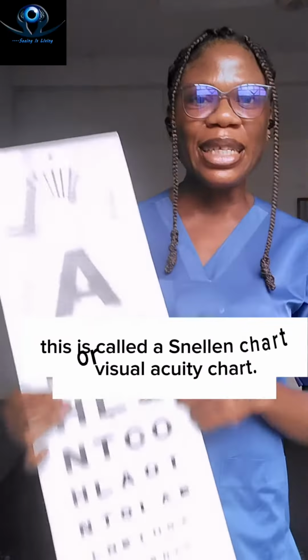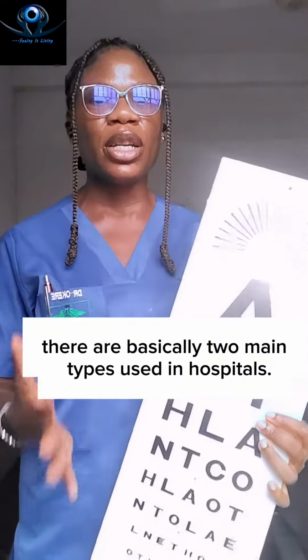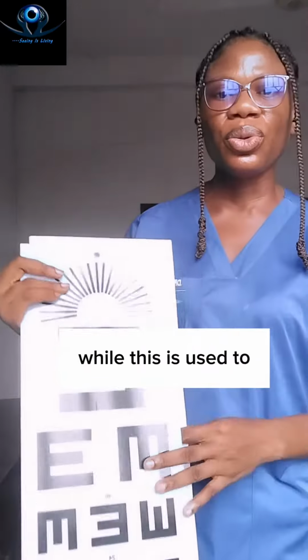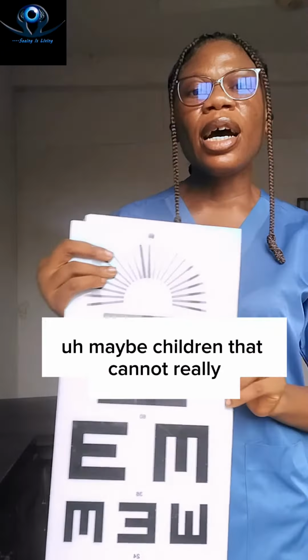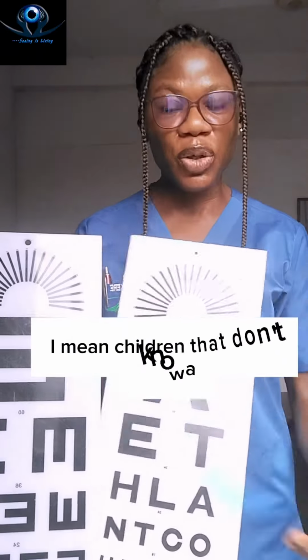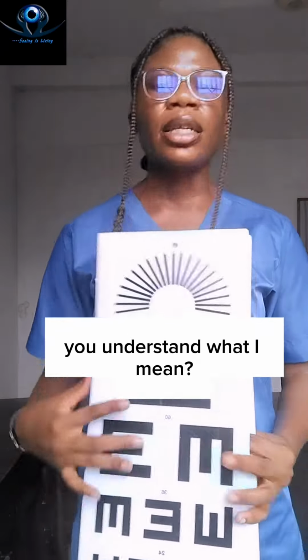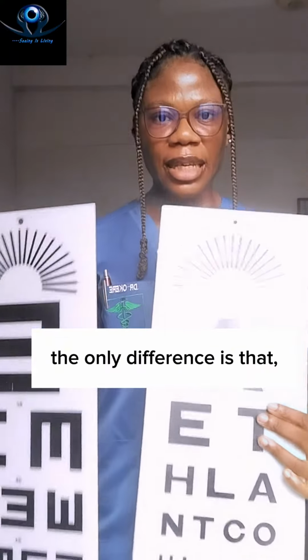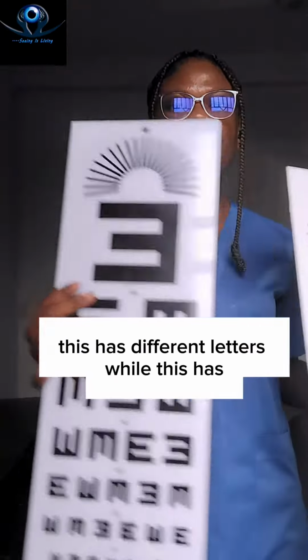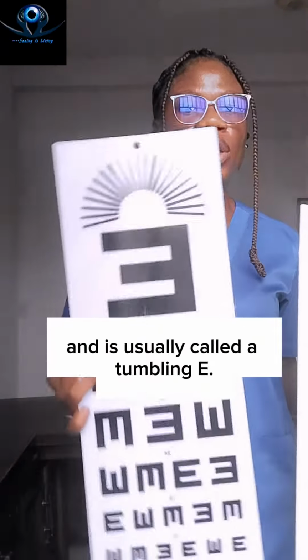This is called a Snellen chart or a visual acuity chart. There are basically two major types used in hospitals, this and this. This is the major one used. Why is this used to examine people, maybe children that cannot really differentiate between A and B, I mean children that don't know A, B, C, D, and also maybe adults that don't know? Two of them give the same results. These two charts are also the same. The only difference is that this has different letters while this has a particular letter, letter E, and it's usually called a tumbling E.